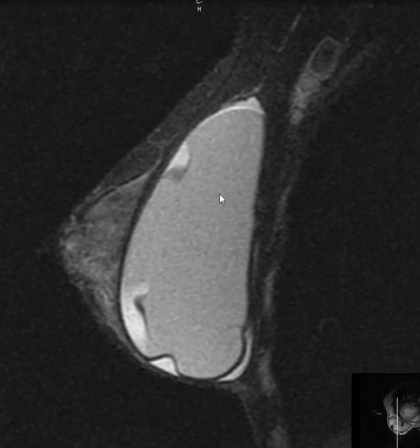We see the silicone here — the intermediate gray signal that's homogeneous. Outside of that is fluid that's contained within the fibrous capsule, but leaked out of this collapsed, partially collapsed gel capsule. And that's fluid around the rim.